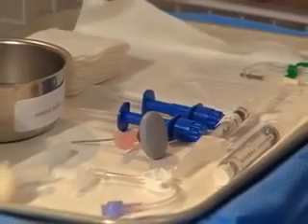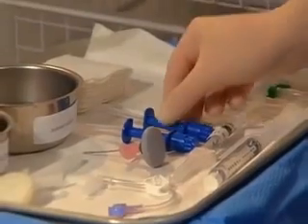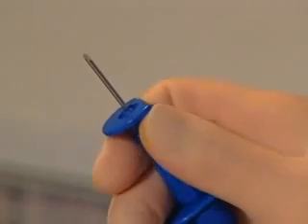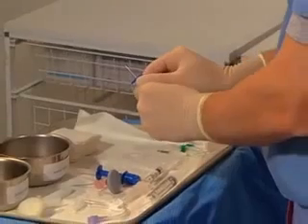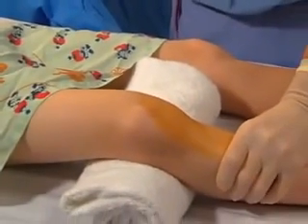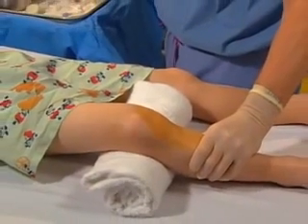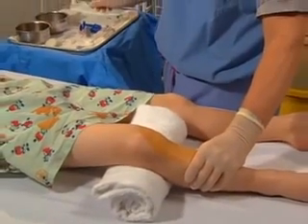When using manual insertion, remove the safety cap from the needle. Ensure that the stylet is appropriately placed within the needle and that the bevels are aligned. Using your non-dominant hand, stabilize the limb distal to the insertion site. This allows for counterpressure against the advancing needle and prevents unexpected patient movement.